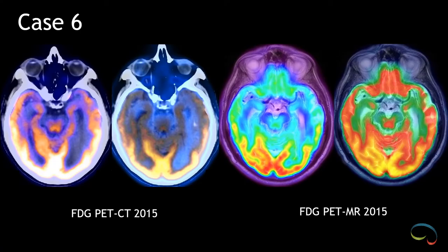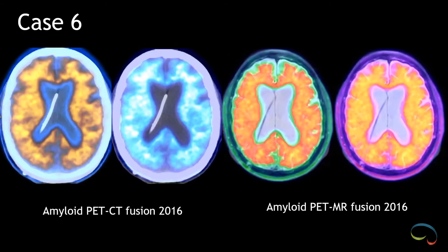The same NPH patient also came for an FDG brain PET CT in 2015, demonstrating cortical hypometabolism in the bilateral temporal lobes, which was statistically significant only on the left side. And finally, this patient came back for an amyloid PET CT study in 2016. You can see the shunt in place and the diffuse binding of the amyloid tracer to the amyloid plaque in the cortex.